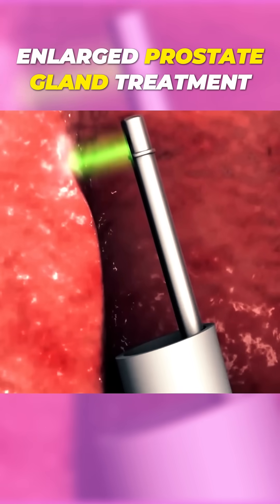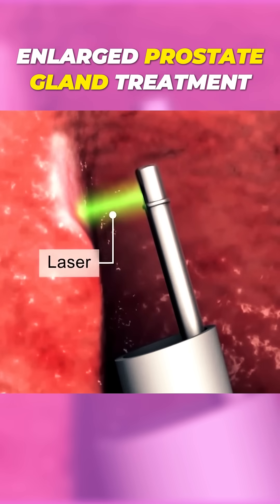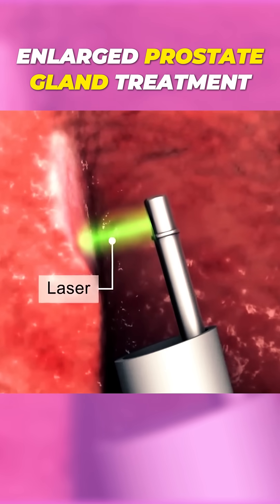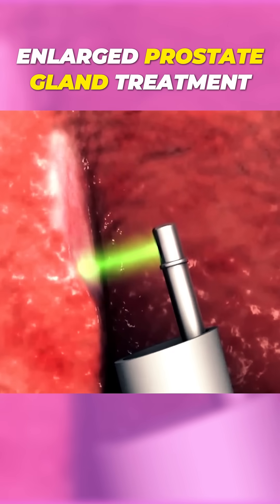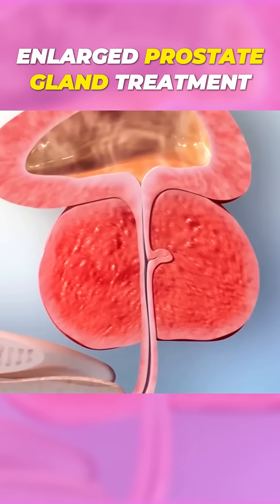Other minimally invasive variations on this type of procedure use lasers, microwaves, radio waves, or electrical energy from tools inserted through the resectoscope to remove some or all of your prostate gland.